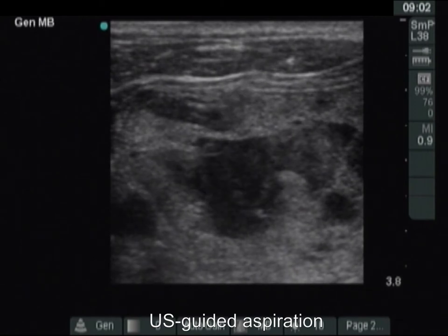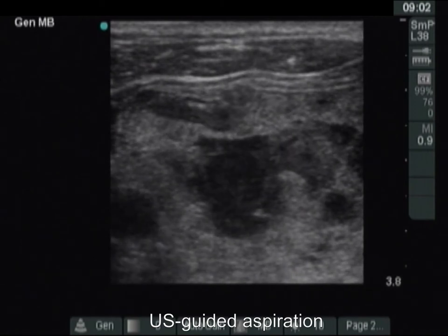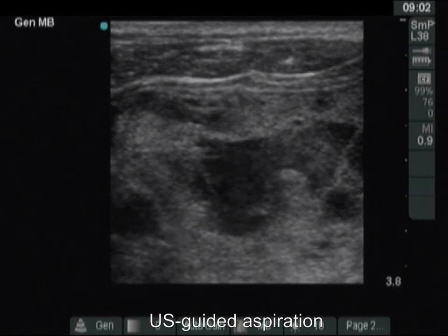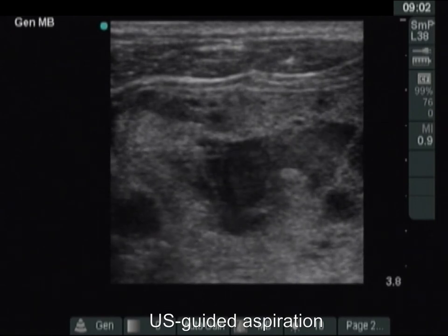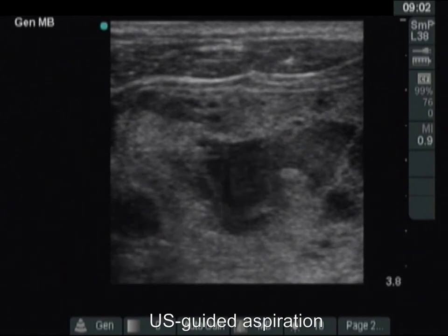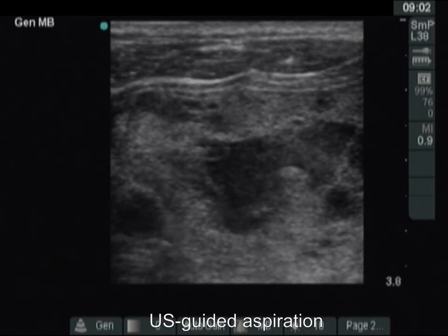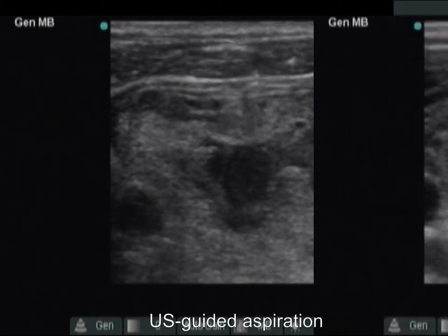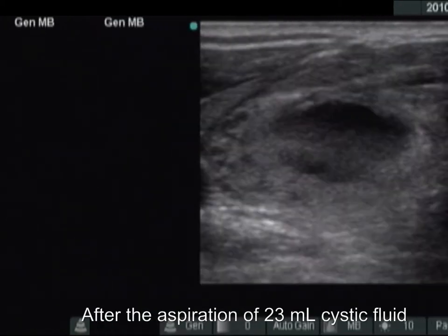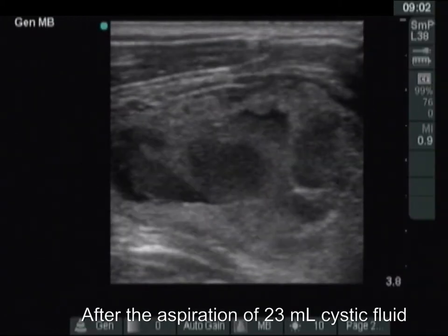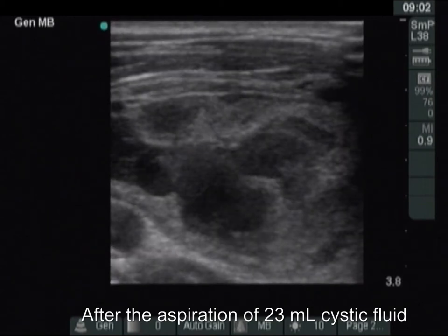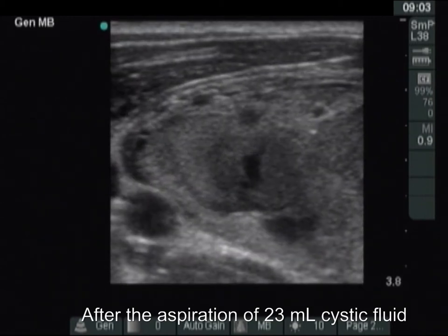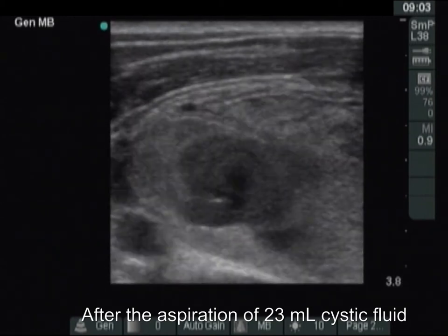The needle is within the dorsal chamber, but instead of a decrease, the size of this area increases. The cystic fluid occluded an artery, and as we draw out the cyst, this occlusion ceases. Although 23 milliliters of cystic fluid has been aspirated, the size of the lesion remained the same.